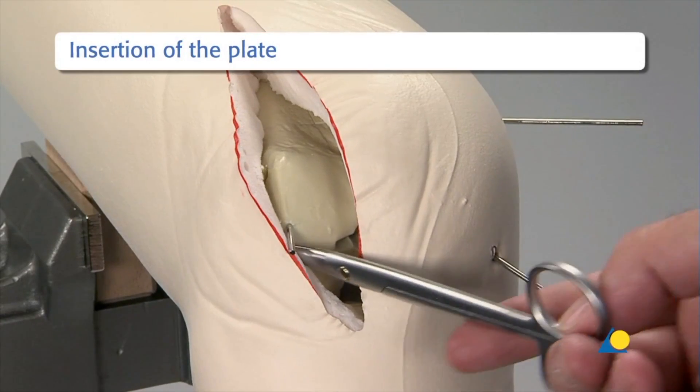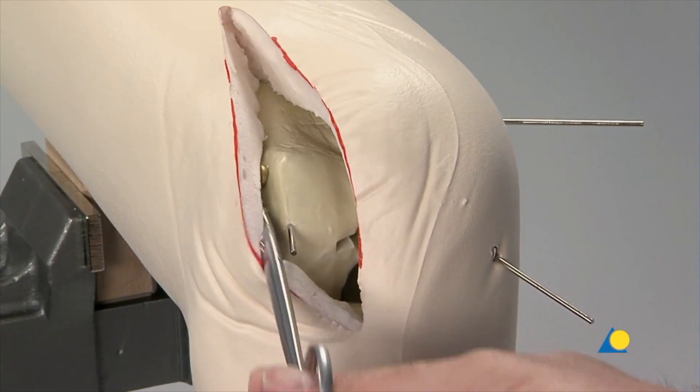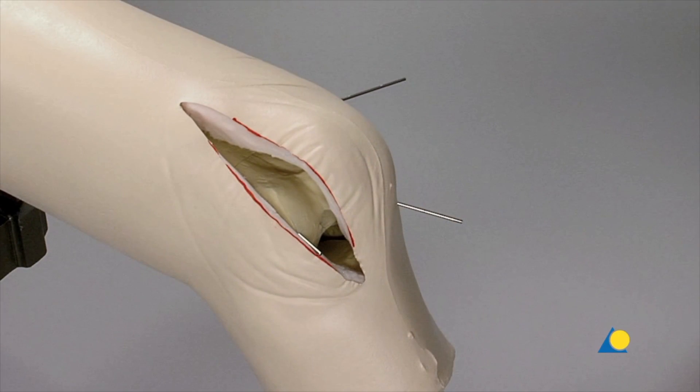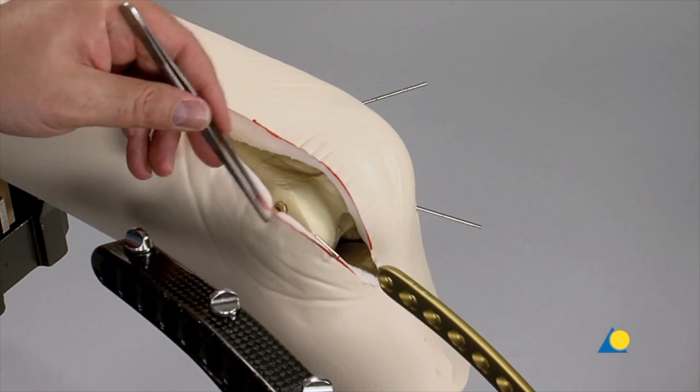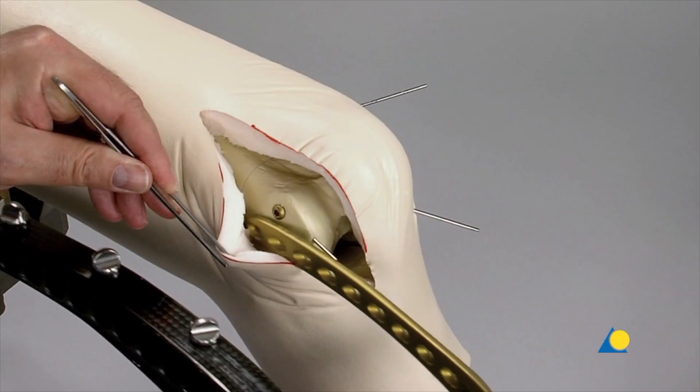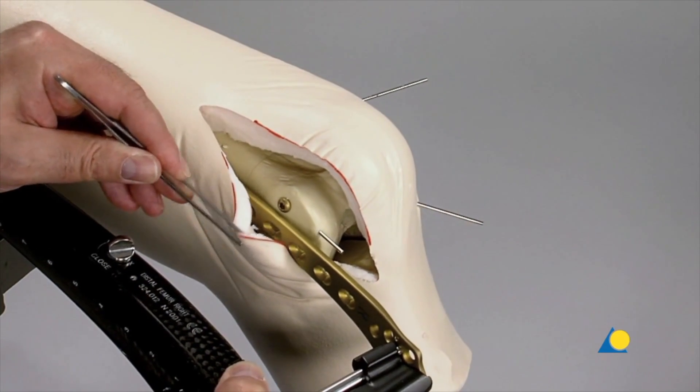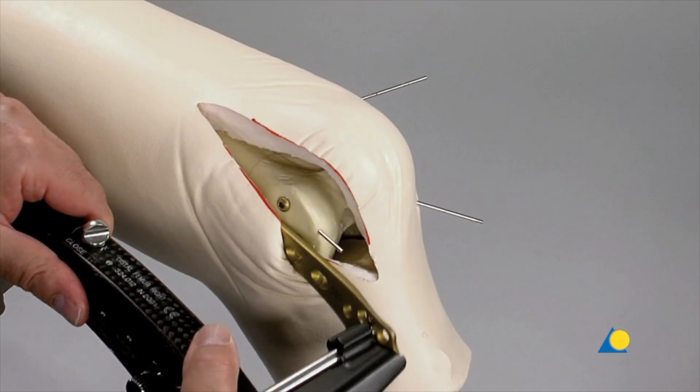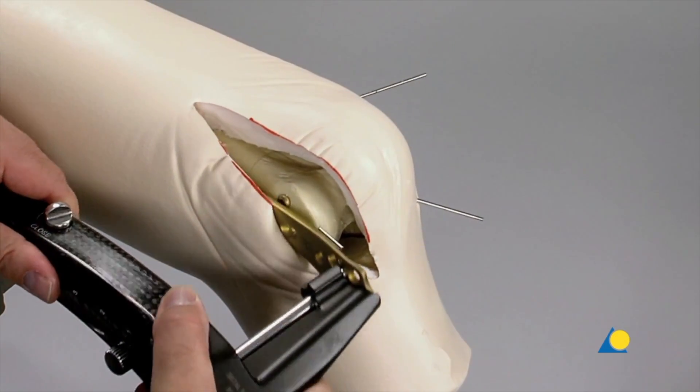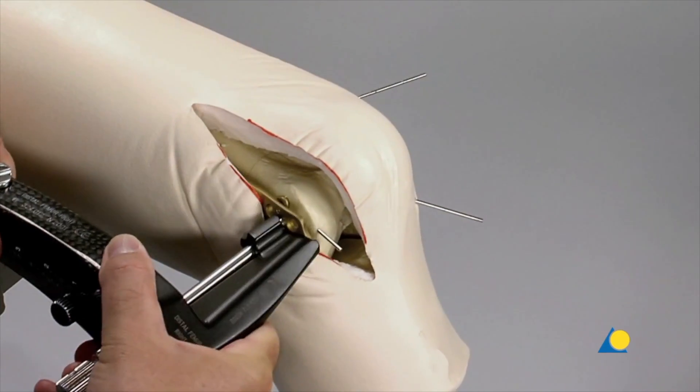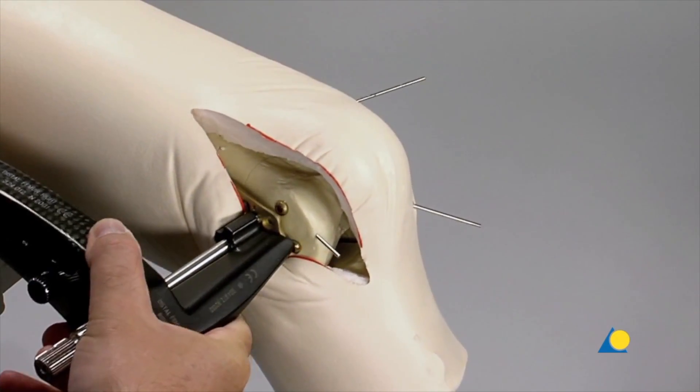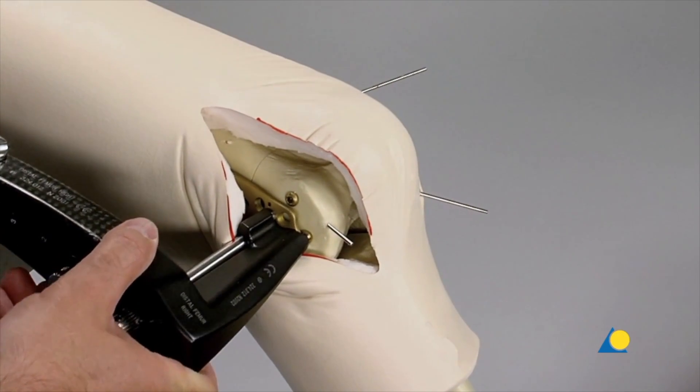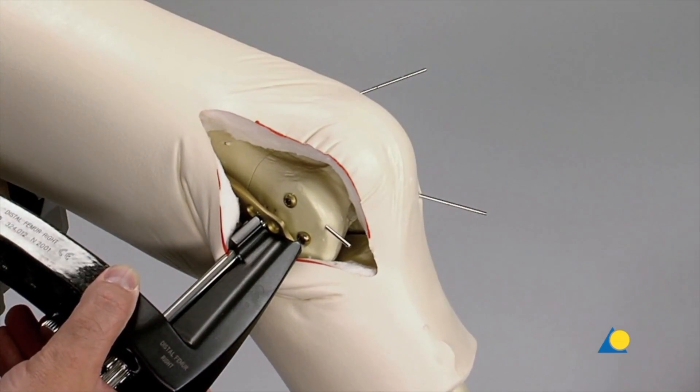The scissors is used to create a tunnel beneath the vastus lateralis. The plate can now be slid through the parapatellar approach, under the vastus lateralis muscle, and along the femur. It is important to move the plate up and down slightly while inserting it. These movements are important to ensure that the plate stays on the bone and does not injure the soft tissues. It should be emphasized that the plate is aligned to the oblique lateral condyle of the femur, due to the trapezoid shape of the distal femur in the axial plane.